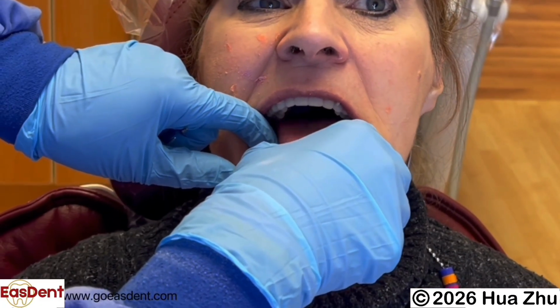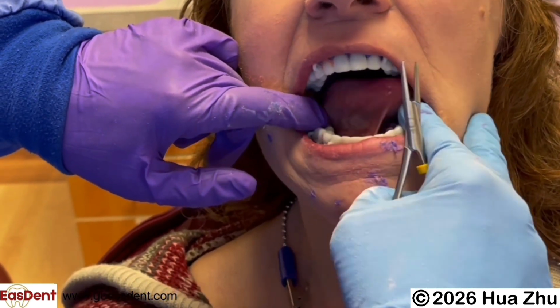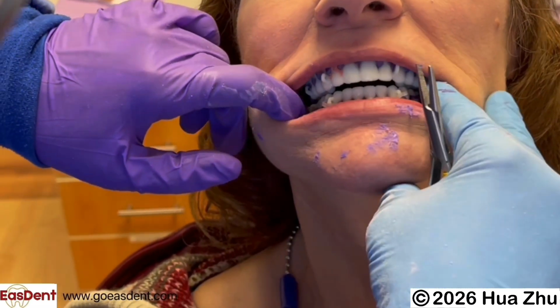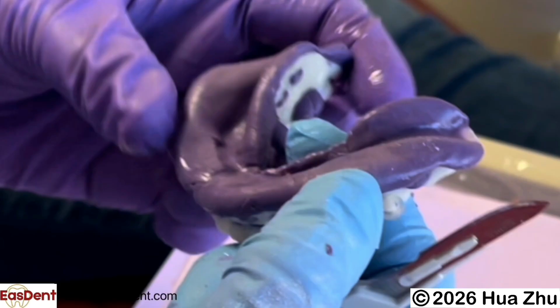Hold the mandibular tray in position. Let the patient move the tongue around to mold the lingual border. By the time the elastomer is removed, the putty PVS material might be partially set. It might be difficult to mold the border very well, and it might be easier to get an overextension. That's why you should not put too much moldable material in the lingual. Putty impression material will self-set completely in about 5 minutes. Now you have a customized mandibular Easdent tray that records teeth position and jaw relationship.